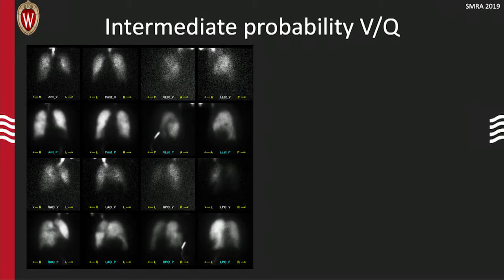Now, the other imaging modality that is frequently used clinically is ventilation perfusion scanning, and this is available pretty much all over the world, but again, the technetium that is being used can be scarce. It's very expensive. We don't necessarily have nuclear medicine technologists available in-house 24/7, so it might take a couple hours to get that technologist to come in and get everything set up if you've got a patient you want to evaluate at 2 in the morning.